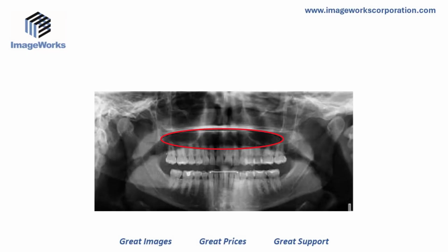This approach will not solve this problem because the goal is to remove the air gap between the tongue and the hard palate. Instead, we recommend that the operator should instruct the patient to press the tongue flat against the roof, which will better remove the air gap that can cause this artifact.